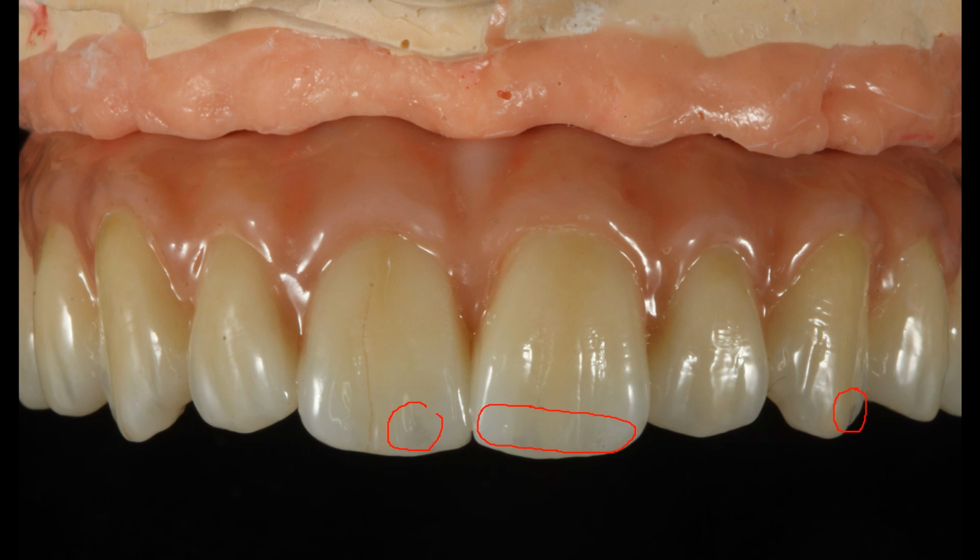In a person who wanted something very characterized, you'll notice right here, I won't go over it because you won't see it if I go over it, but I'm going to go just next to this artificial crack line. Teeth always have cracks. Even natural healthy teeth have micro cracks in them. So we try to simulate those here and there. You'll notice the difference. They're not just flat. They actually have some anatomy to them, like natural teeth do and should. And all this comes together to create a very realistic, lifelike outcome.